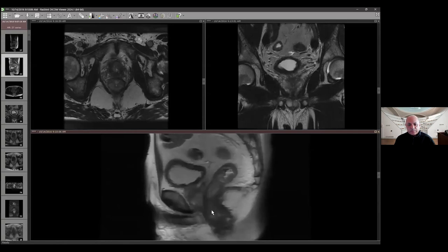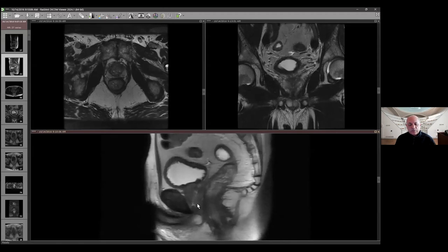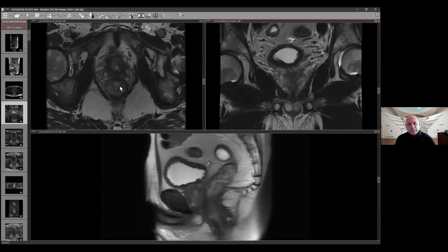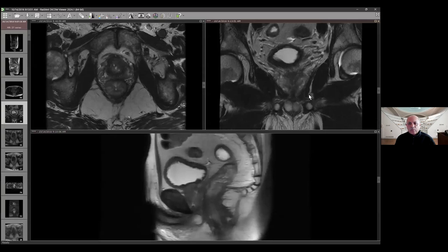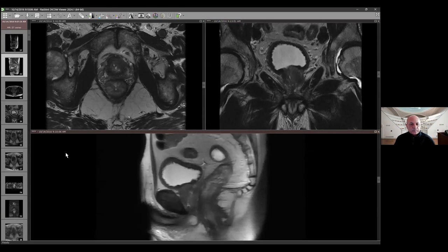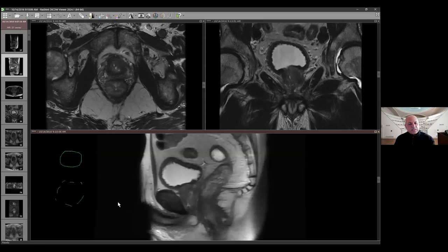When you look at the peripheral zone, it is bilaterally symmetric. But when you come to the transition zone, you see this area of concern. When do you start getting concerned in the transition zone? You start worrying when you have an interrupted capsule — for a BPH nodule, you want to see a complete capsule. If the capsule is interrupted, look at diffusion — if there is restricted diffusion, start worrying. And if there is no capsule at all, whether interrupted or complete, that's when you really start worrying.